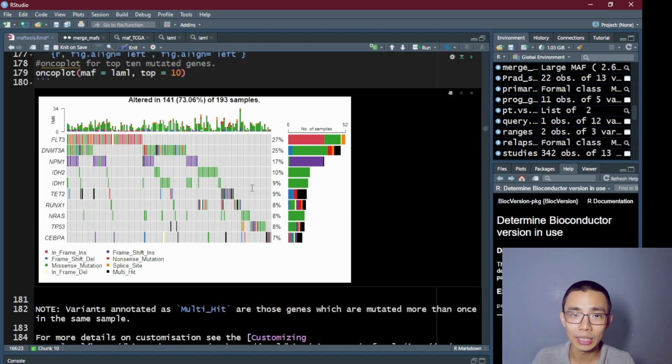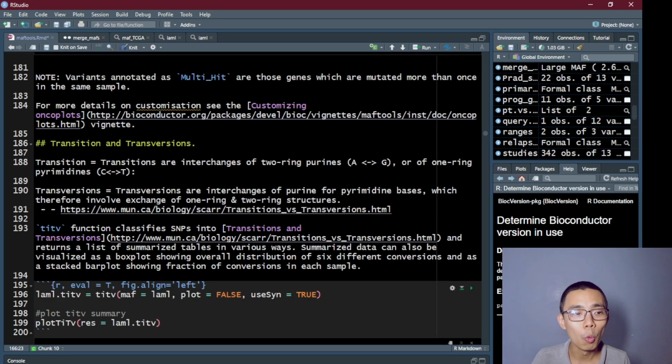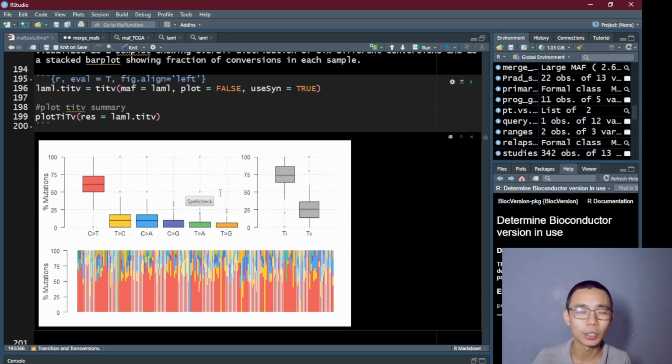So there's more information here that you can actually try to identify a point. There are a little bit more wording here that you can actually read and try to understand, but I'm just going to talk through it because I'm saying the same thing as the words, and research shows it's not good to show the word and say the same thing because people get distracted. So if you do want, pause the video and you can go back to the script and read it yourself.